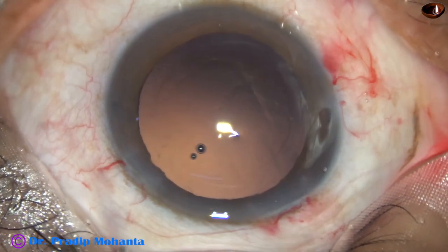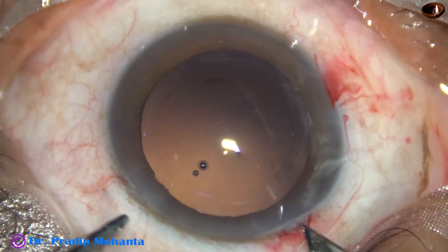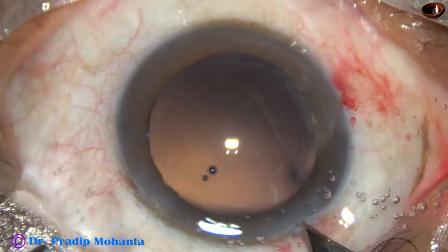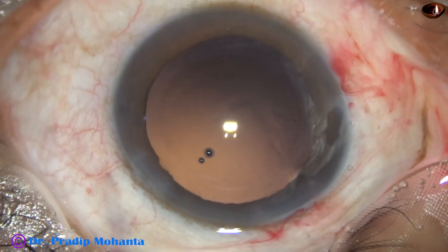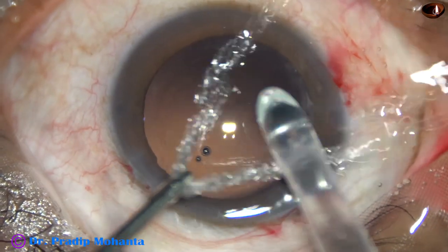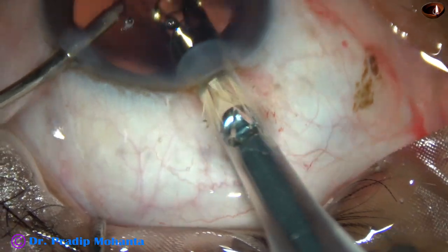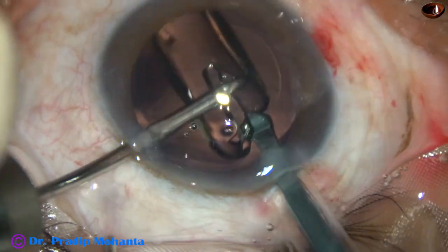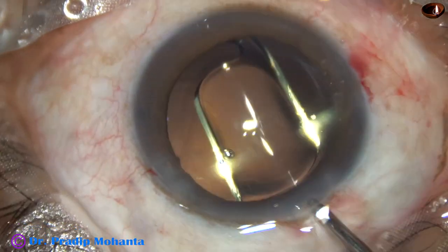And now is the time to implant an intraocular lens. I'm using a B cartridge, so I'm going to enlarge the main wound a little bit. And now, this is Super 4 from Appasamy Associates.